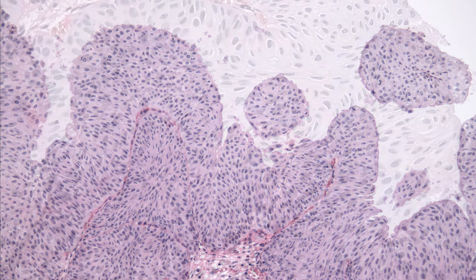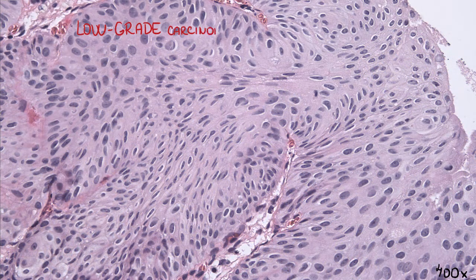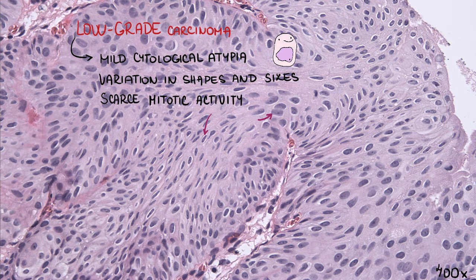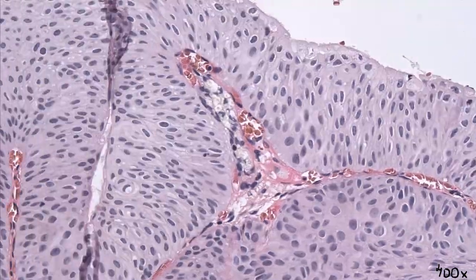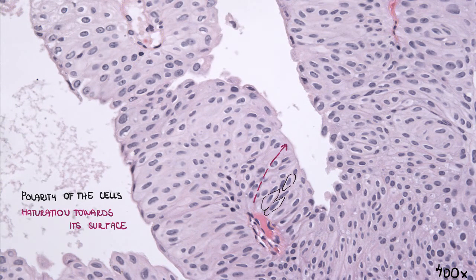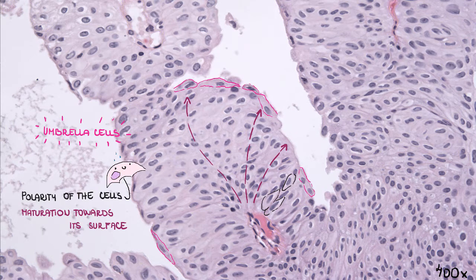In the case of low-grade carcinoma, the cells show mild cytological atypia, certain variation in shapes and sizes, and scarce mitotic activity. However, the polarity of the cells and the maturation of the epithelium towards its surface is still preserved, although slightly diminished. On the picture, you can even appreciate some umbrella cells.